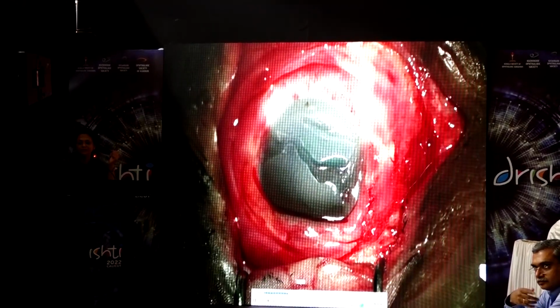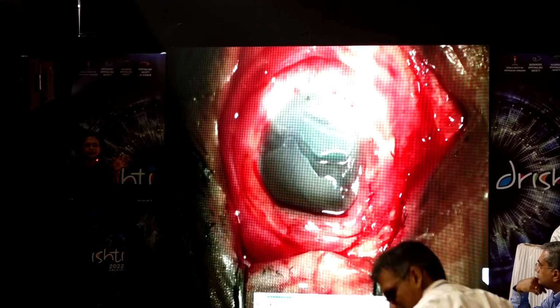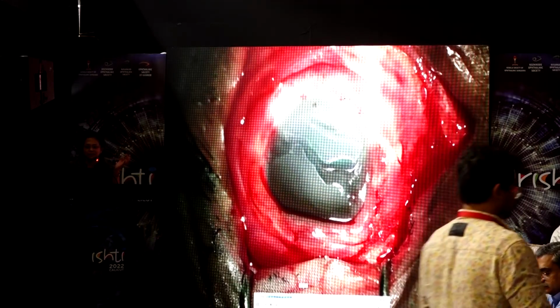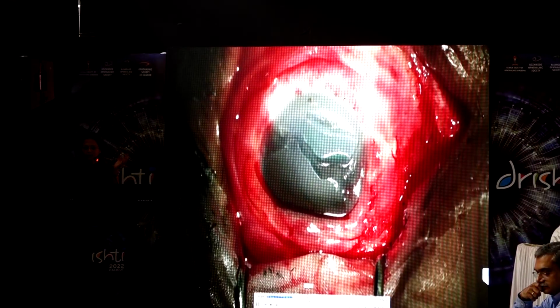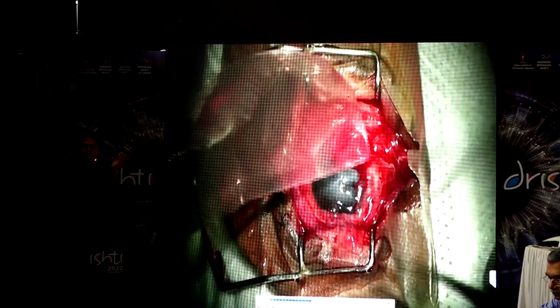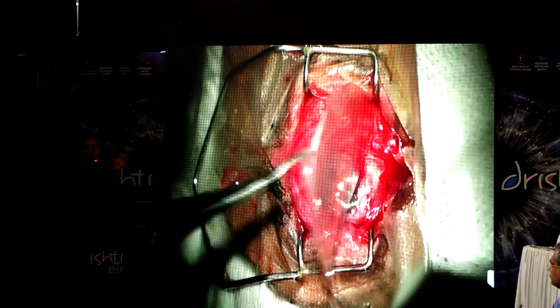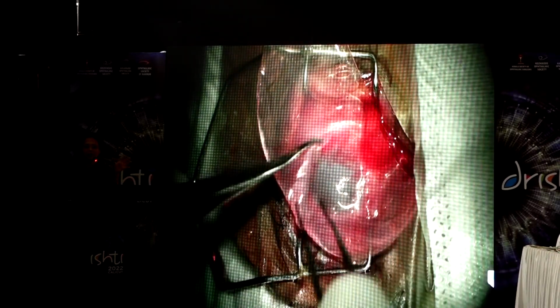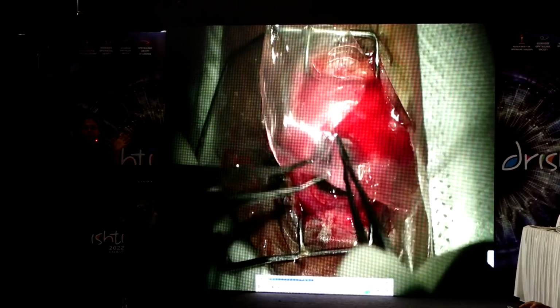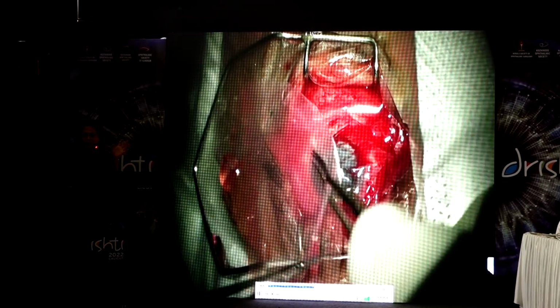In this case, this patient has already been on medical management for a significant period of time, and now to enhance the surface epithelial healing, we are taking them on for an amniotic membrane transplantation. The surface is quite inflamed after you've initiated medical management, after you've given a course of antibiotic therapy. So here we are proceeding with putting on an amniotic membrane for this patient. It's going to be an amniotic membrane overlay.